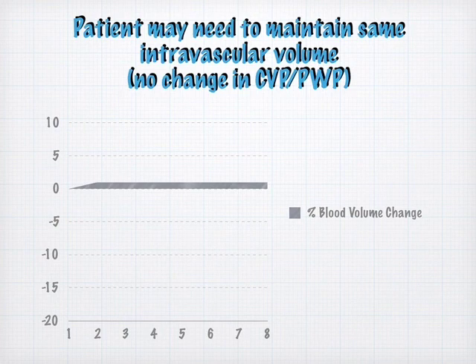What I found is that, for example, if a patient was septic or had surgery or something, they were third spacing fluid for the first couple of days. So I was giving fluid sometimes on dialysis. And then later in the week, I was taking extra fluid off. But the point is that whether they were third spacing fluid or they were recruiting fluid, my job was to maintain the same intravascular volume, and I knew exactly how to do that because I could watch their hematocrit being graphed continuously. If they started drying out, I could slow down how much fluid I was taking off or give them fluid. If they started recruiting fluid in a hurry, then I could remove the fluid at the same rate that they're recruiting it. So it worked very well.